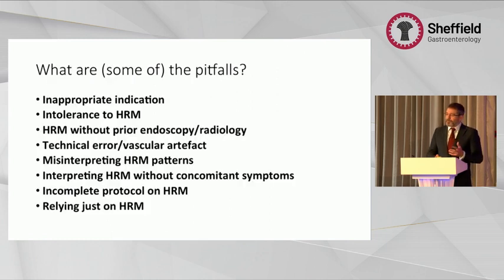So what are the pitfalls in manometry when looking at this big picture? Of course, there are pitfalls in interpreting manometry, the technical understanding and interpretation of the plot. However, there's also pitfalls in defining who should be sent for physiology and how you look at the bigger clinical picture and how to interpret in terms of clinical management. So I'm going to look at all of these points one step at a time and hopefully give you a better understanding.